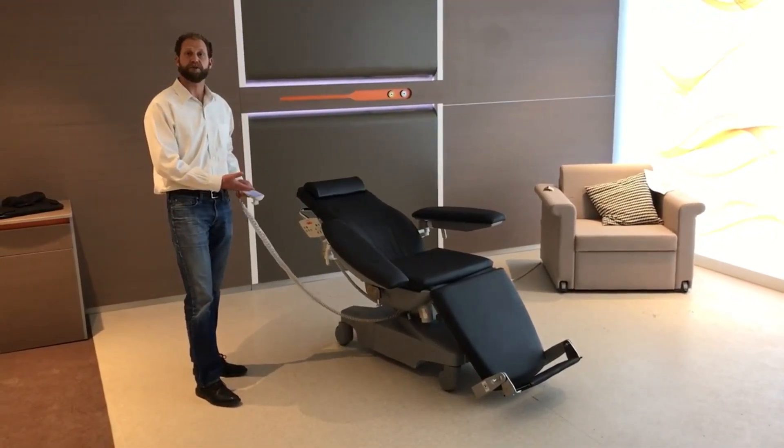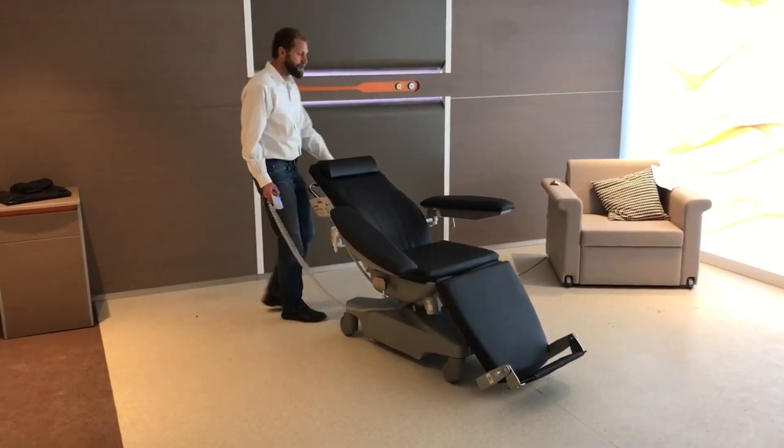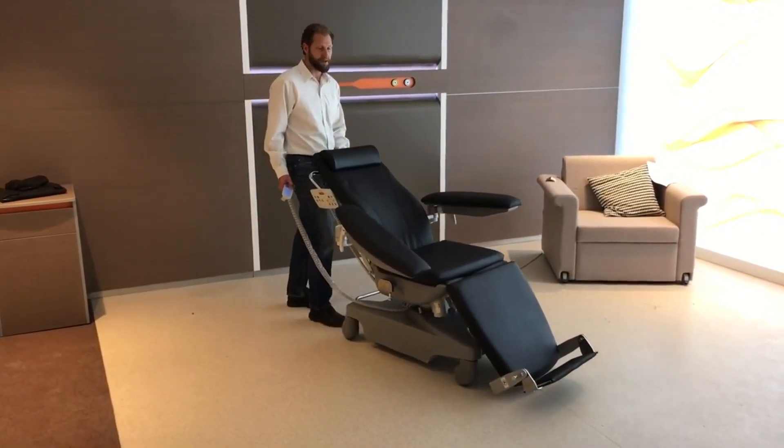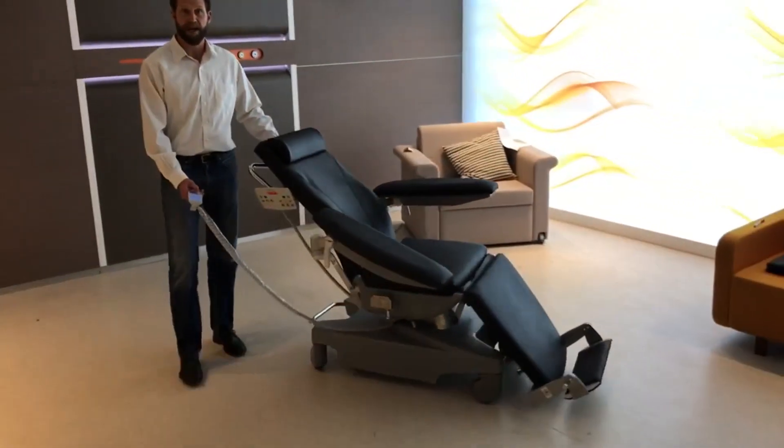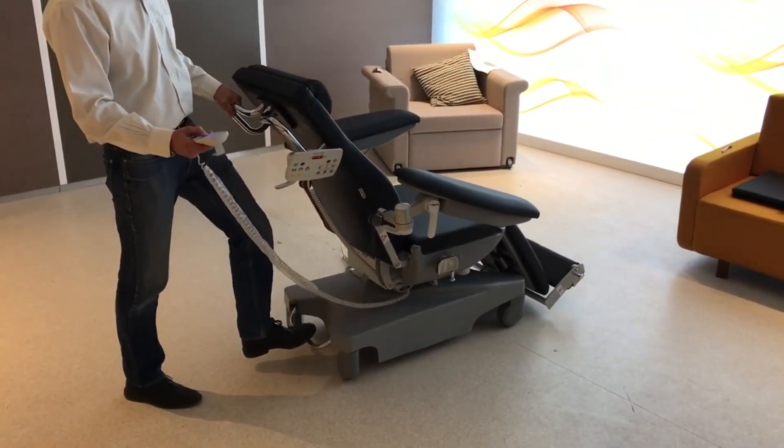Comes standard with a central locking brake and very easy to maneuver. So if you're looking to bring your patient wherever you need to, of course it comes with the battery backup, which is what it's on right now.